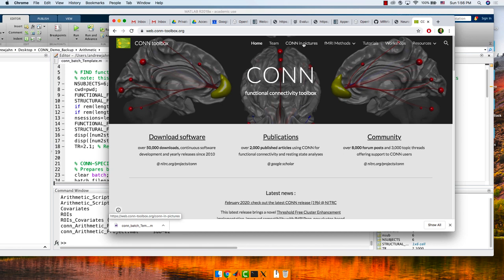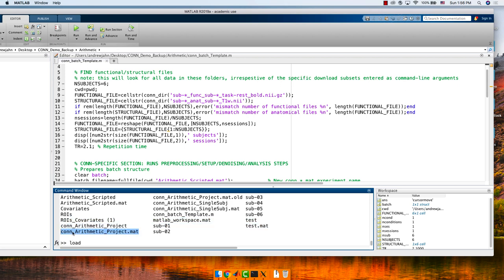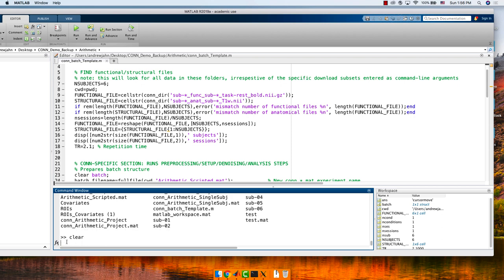Now, if you want to — let's say you have your con_arithmetic_project.mat file — you could load it. So: load con_arithmetic_project.mat. You'll have a CON_x variable in your workspace.